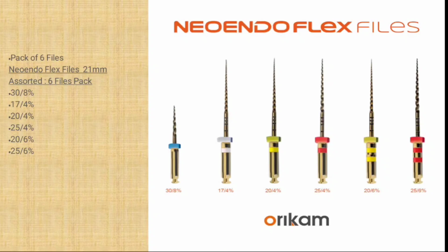If we have one ring here, that means it's 4% taper. If we have 2 rings here, that means it is 6% taper. So NEOENDO flex files come in a pack of 6 files, and they are 30 by 8%, 17 by 4%, 20 by 4%, 25 by 4%, and 20 by 6%, and 25 by 6%.